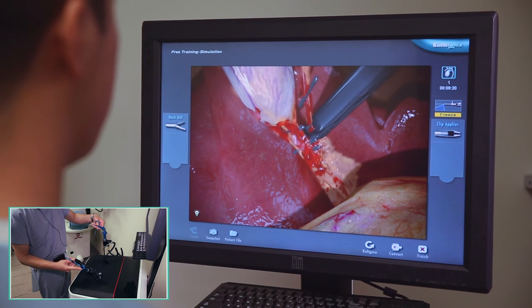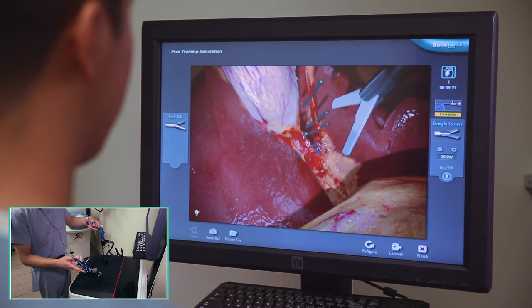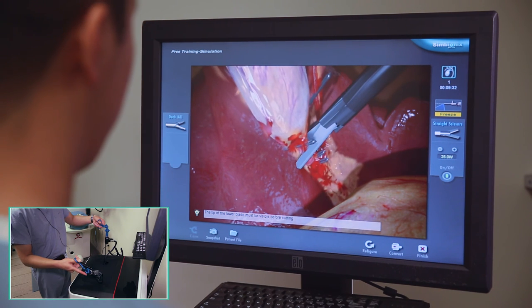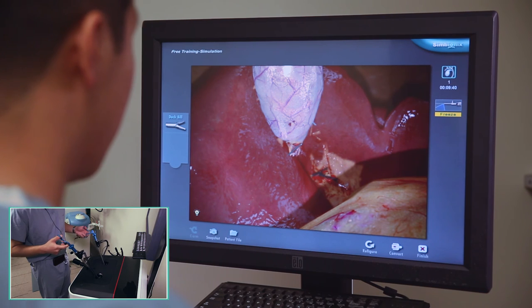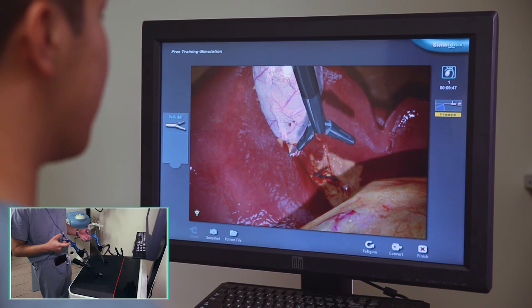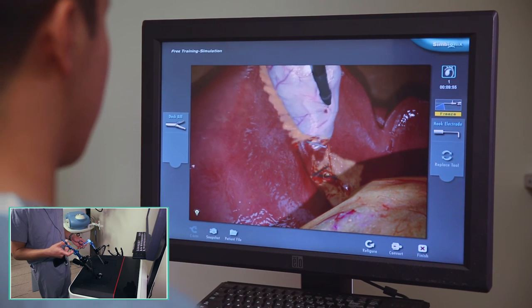You don't need to do these all at once. You can always clip your cystic duct, then cut it, and then go back — that gives you better visualization of your cystic artery. However, if you've done it enough, it's much more efficient to clip them all at the same time and reduce the number of instrument changes. So I've clipped. I'm looking down — I have good hemostasis there. I don't see any oozing or leaking of bile or blood from the patient side where I applied my clips. Now it's just a matter of freeing the gallbladder up off the surface of the liver so that we can take it out.